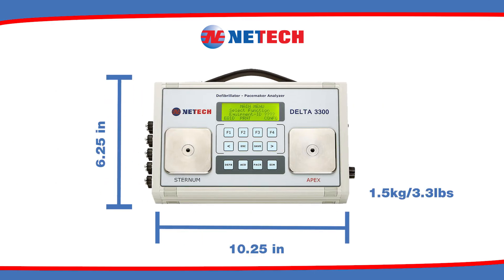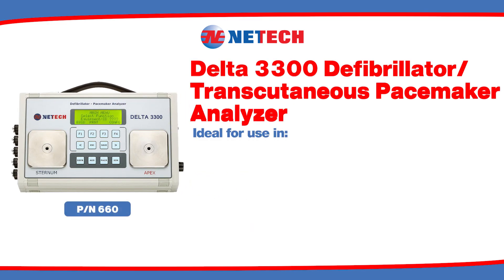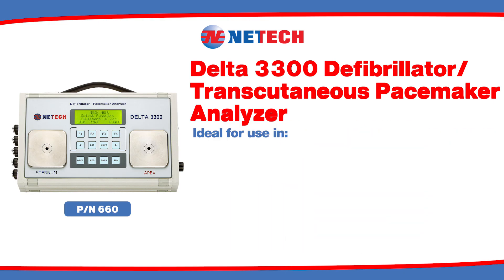This device is compact, lightweight, and easy to use. The Delta 3300 is ideal for use in hospitals, ambulances, sports stadiums, aircrafts, malls, and other remote locations.